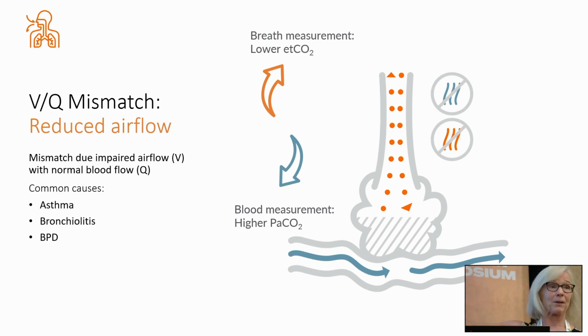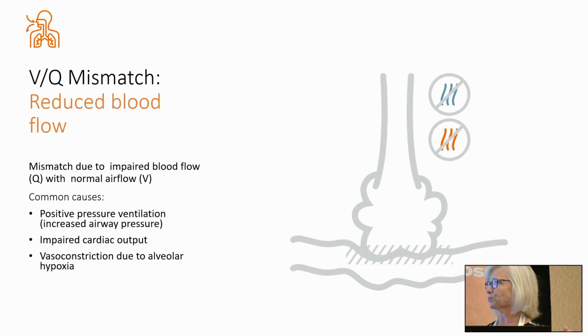So what's going to happen here? Your exhaled CO2 is not going to match your blood CO2. It's going to be lower because the CO2 can't get out. Even though it's higher in the blood, you're not exhaling it properly to be measured properly.